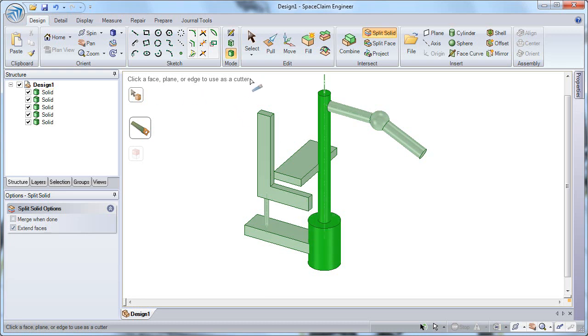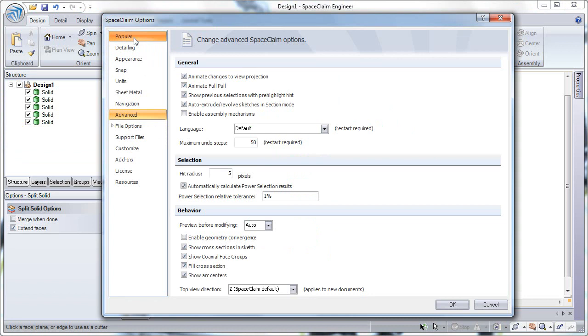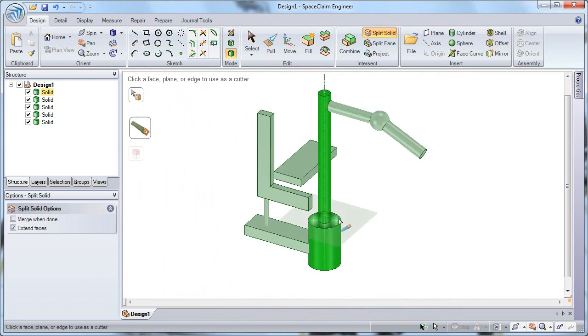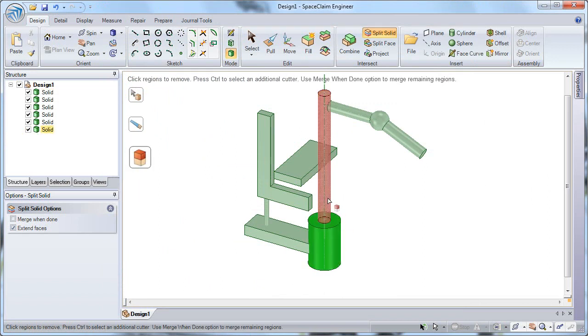And so again, the option that you should toggle on is under the popular options, show status messages in the design window, and that's going to give you that tooltip telling me to select the cutter plane for this Split Solid tool. It's very helpful when you're learning the software. So you can see I've split that now into two separate pieces.